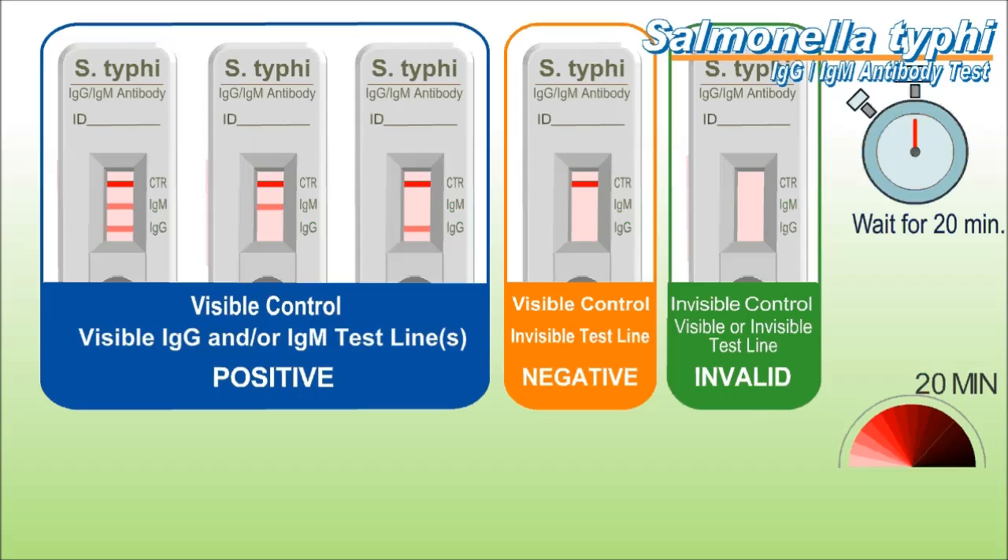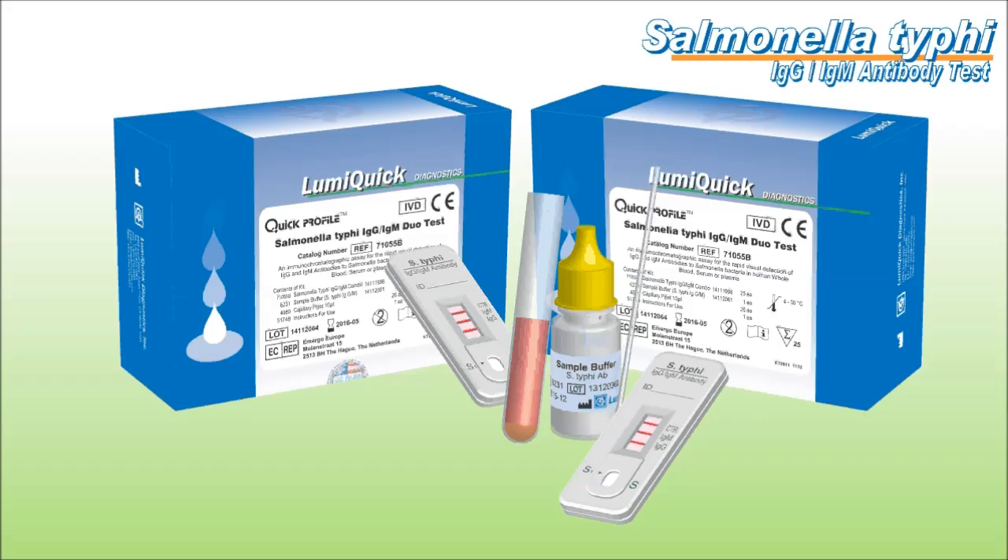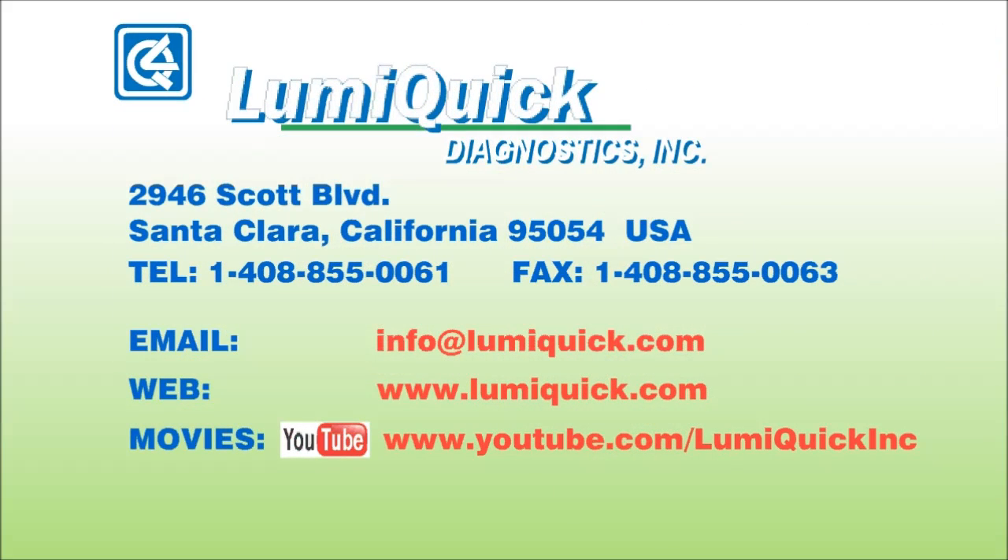Read results. For more details about this product, please consult our instructions for use or contact us. If you are interested in doing business with us or in any of our products, please feel free to send your inquiries to info@lumiquick.com or visit our website at www.lumiquick.com.